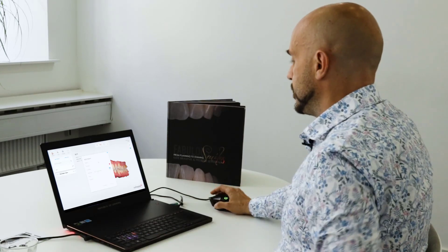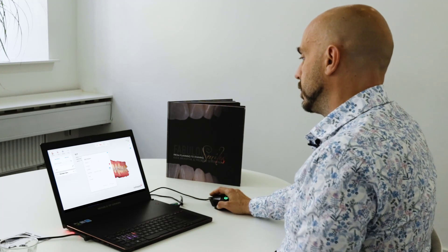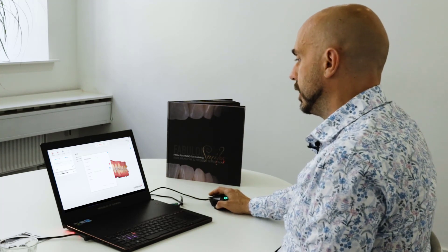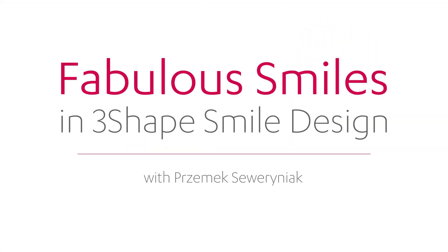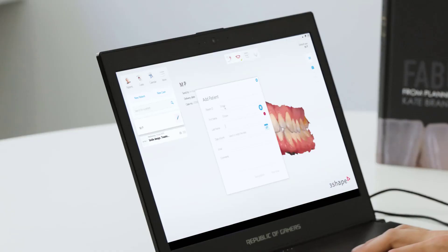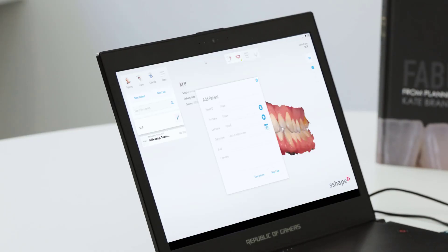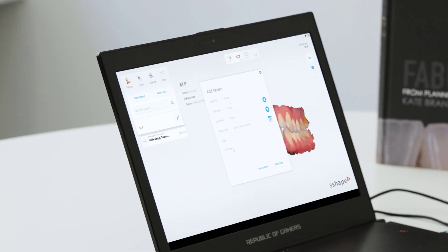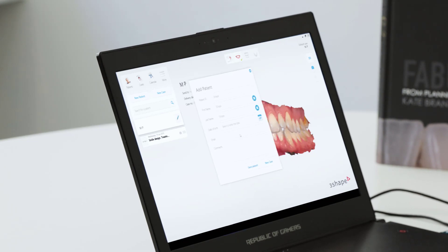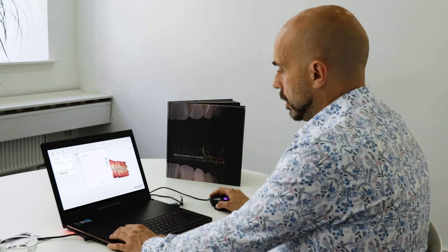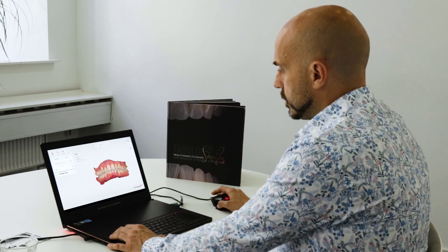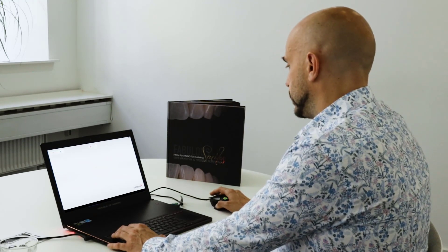When we have our patient, we're going to do the smile design. So I'm going to add the patient and we can just call it 'tree shape patient'. You set the patient ID, the first name and the last name. When you're done, you press 'New Case'.